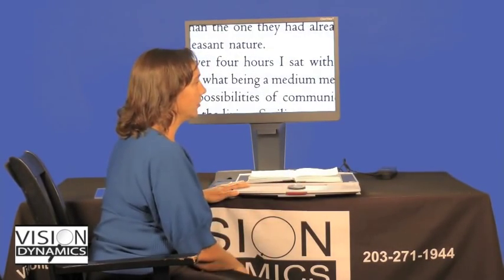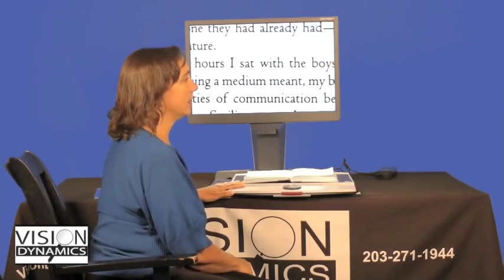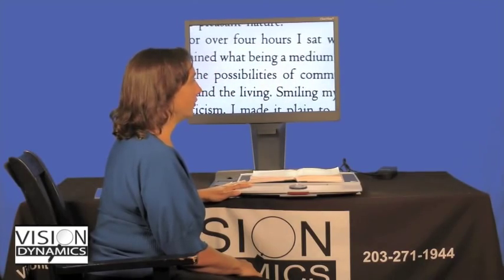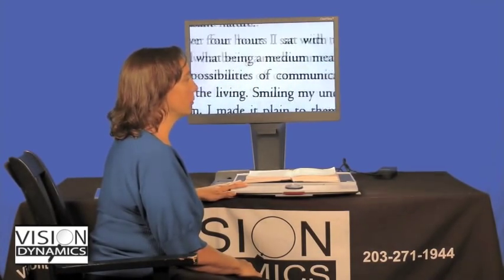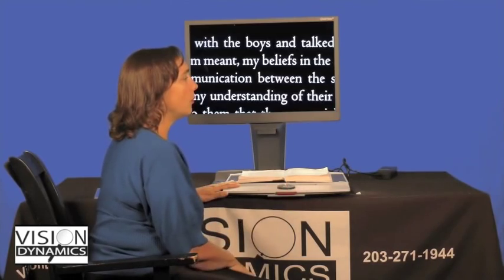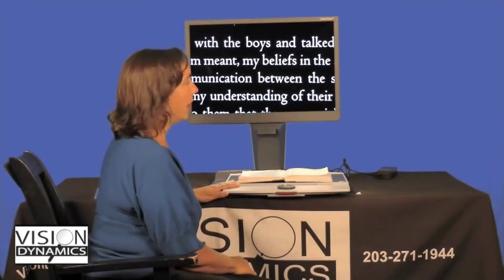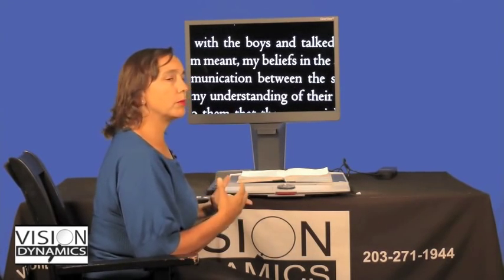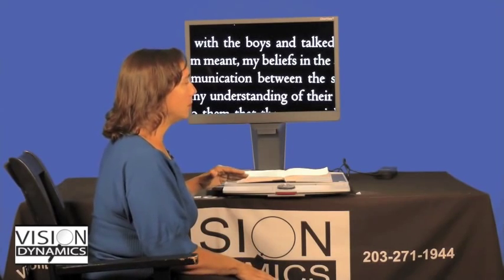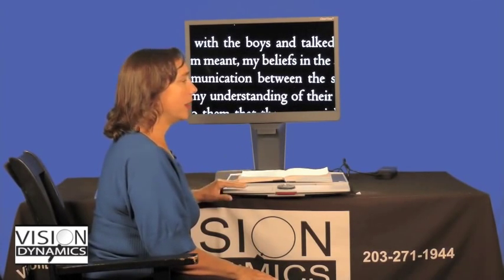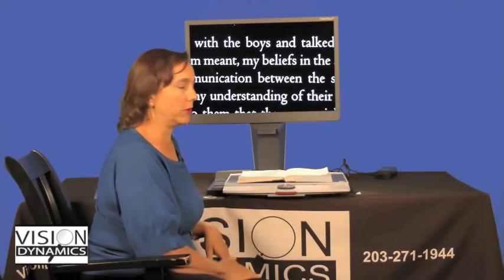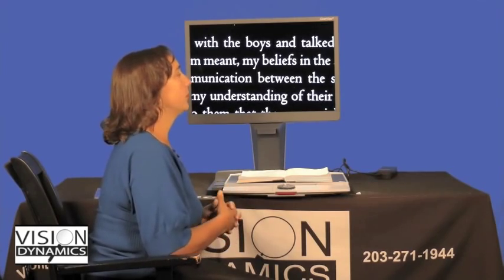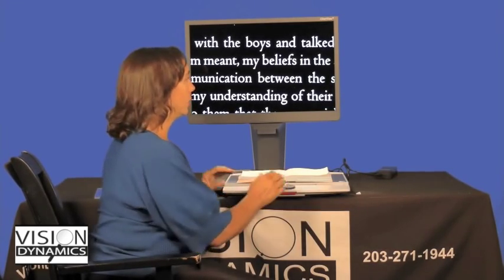And actually I'm going to push it one more time and bring it into high contrast black on white. That's the most common color mode that our customers use. They like the black on white. I have to say, though, with newsprint, white on black is very popular because it tends to clean up the background of the newspaper. Newspaper is very poor quality paper, very grainy. People tend to try the white on black with newspaper because it seems to clean up the background a little bit. So you may want to try that as you're practicing. But on average, when they're reading books, magazines, the white on black is very popular.